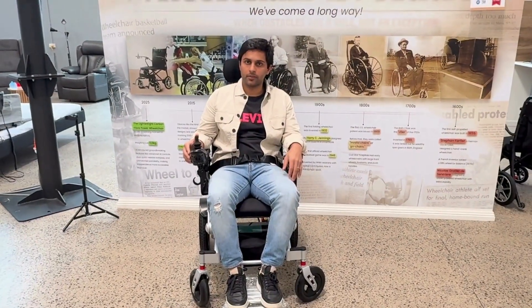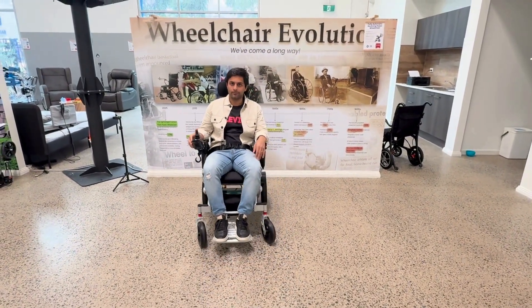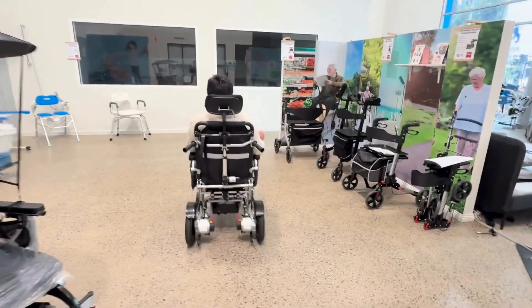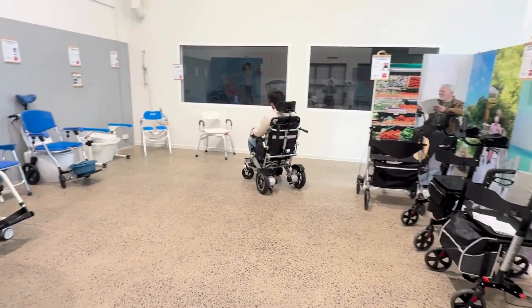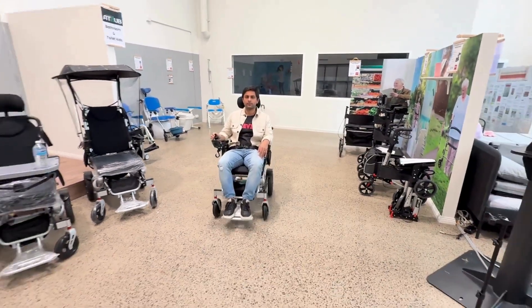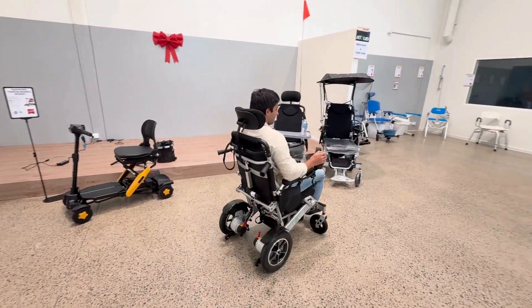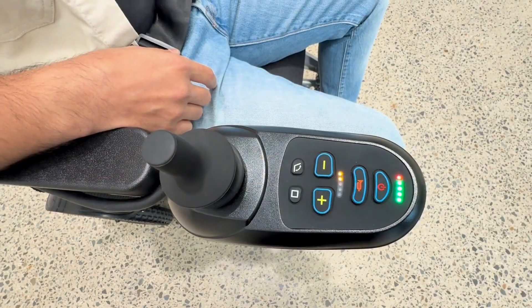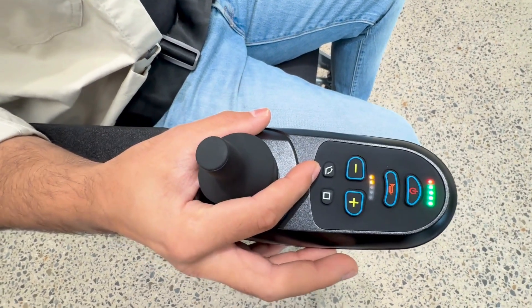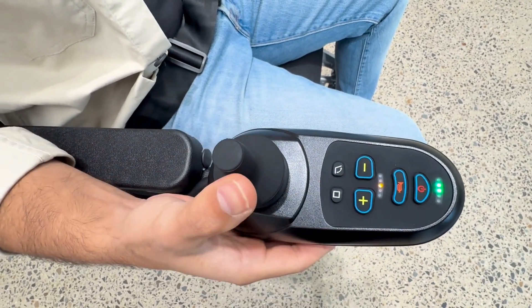Once you push this joystick forward, it will start moving in the forward direction. Once you push it backwards, it will start moving in reverse direction. Now I will show you how to recline this wheelchair using this controller. First, you need to press this reclining button for a couple of seconds. Then press this mode button. Now you can start reclining the wheelchair.